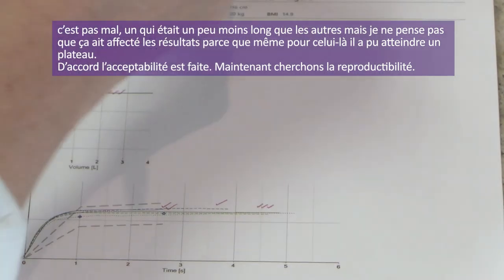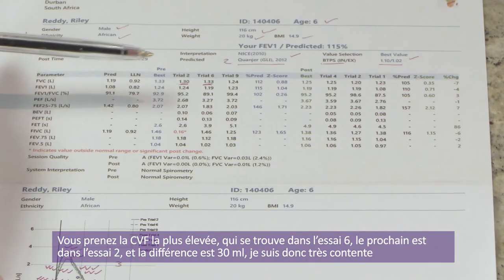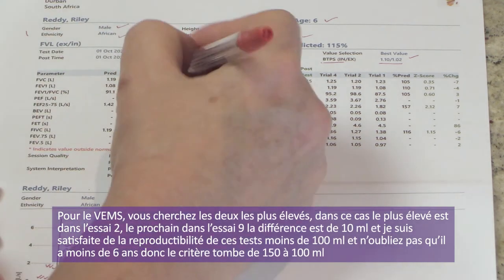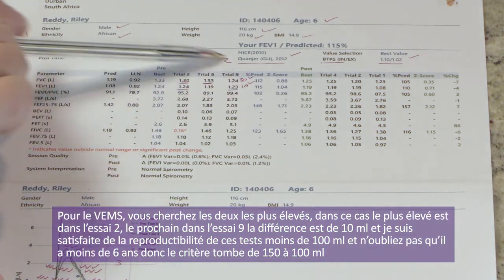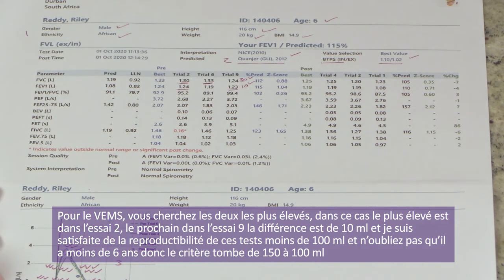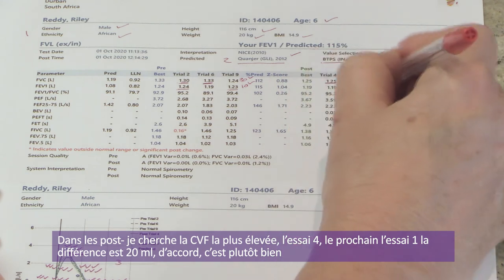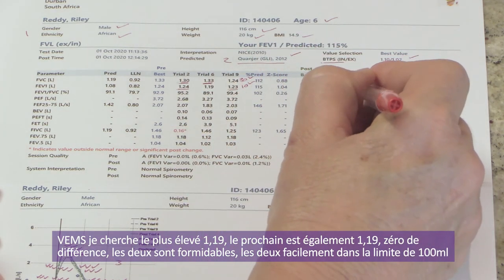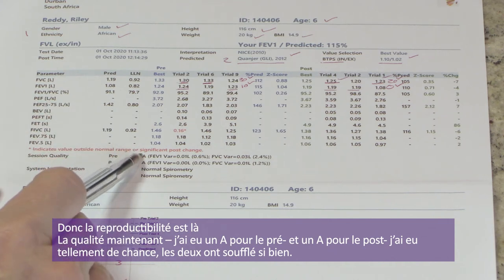Forced expiratory times are 2.6, 3.9, 5.1, 4.9, 4.6, and 4.5 seconds. The one was a little less than the others but didn't affect the result because even on that one there is a plateau. Repeatability: highest FVC is in trial six, next highest in trial two — difference is 30 mils. FEV1 highest in trial two, second highest in trial nine — difference is 10 mils. Very happy with repeatability. Note that he's under six, so the criteria changes from 150 to 100 mils.